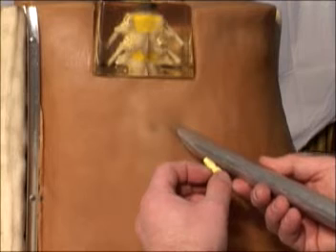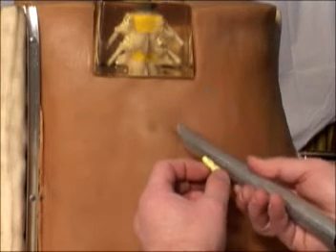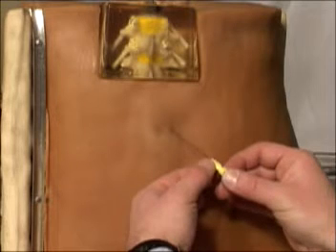With this adult model, we introduce the needle at about 2-3 cm lateral to the midline, opposite the center of the inner space, at an angle of about 25 degrees, pointing cephalad, bevel facing the skin, with the needle aimed at the dura.